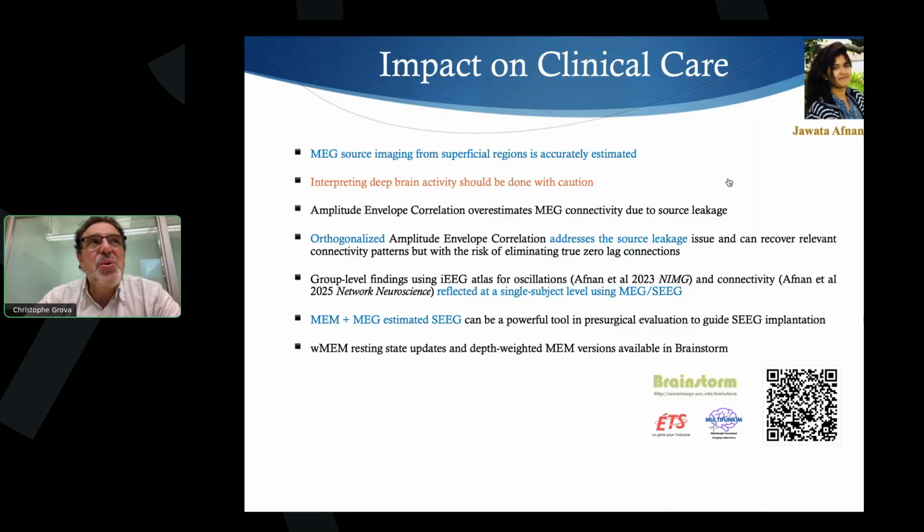I'm not sure. It could perhaps in some cases, but what I am convinced of is that, especially because we can mimic, and that's what we are working on right now, you can predict from MEG data or from EEG, it's the same, how the SEEG signal would look like according to your source imaging. You could then optimize a bit more quantitatively the implantation. So it doesn't mean we avoid completely the clinical decision. It's not a pure automatic implantation.